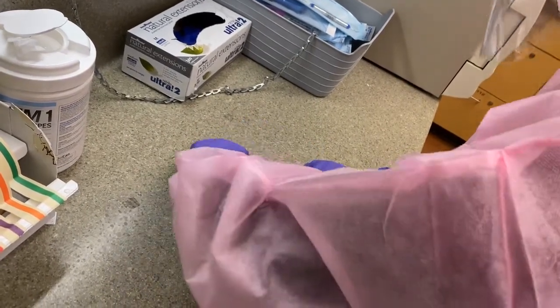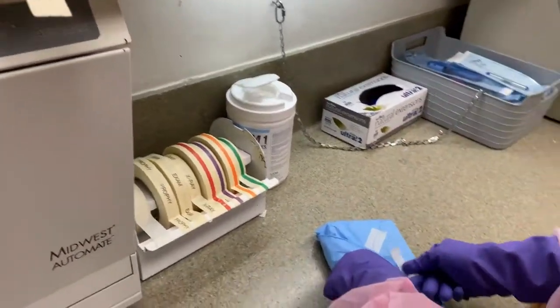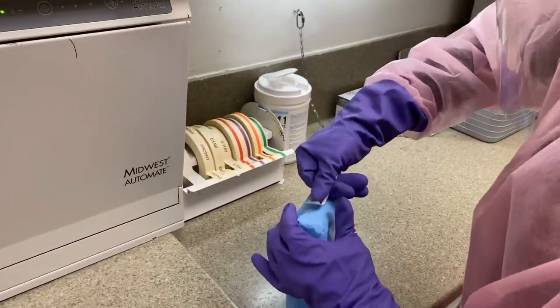After wrapping the cassette, place the correct tape label with the clinician's first and last initial, as well as their number. This tape has the parameter of temperature only.